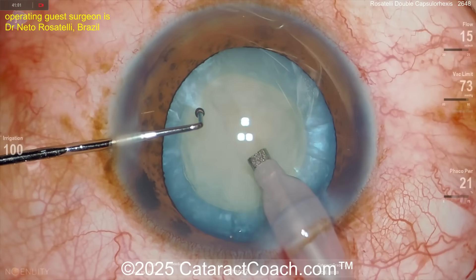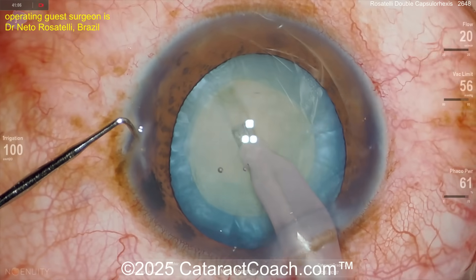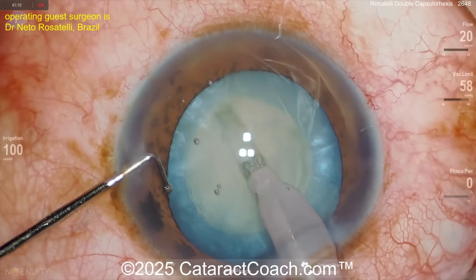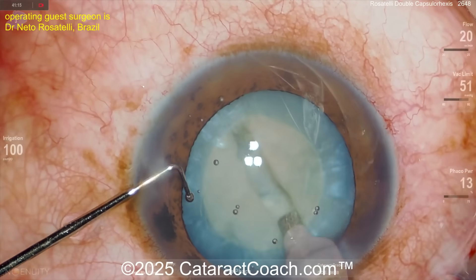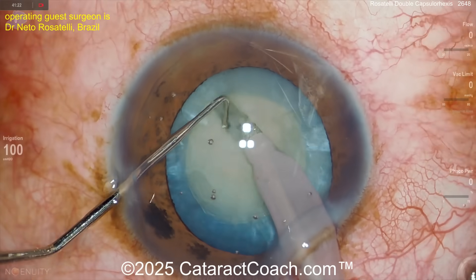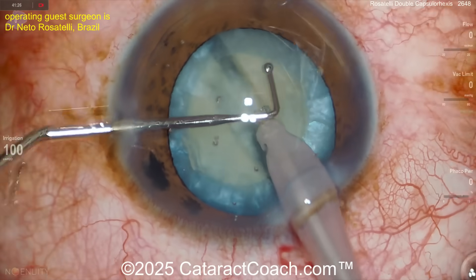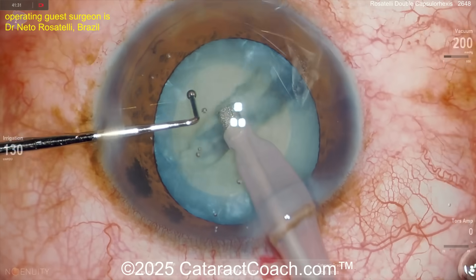You might ask: why isn't Netto doing the Rosatelli spin — that characteristic spin where you spin the nucleus many times in both directions to loosen up lens cortex? Well, the liquefied lens cortex is already gone, so there's really no cortex left. And why stop and chop instead of quick chop? Because a great surgeon knows all the techniques. You need to learn them all — if you love stop and chop, great; if you love divide and conquer, great — but learn the others too.